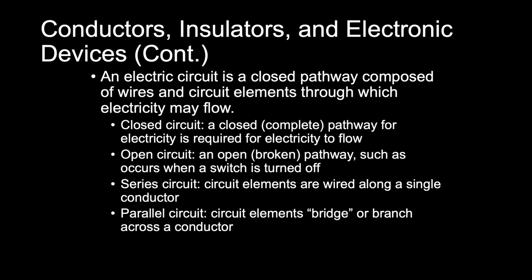The elements of a circuit may be arranged in series. It's called a series circuit. Or also in parallel, called a parallel circuit. And if there's a combination of both series and parallel, it's called a series-parallel or a combination.